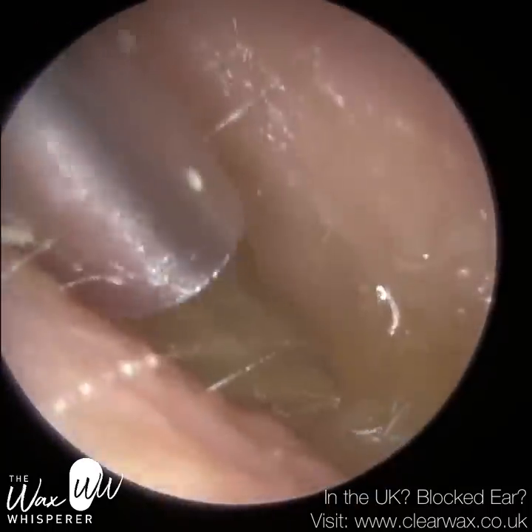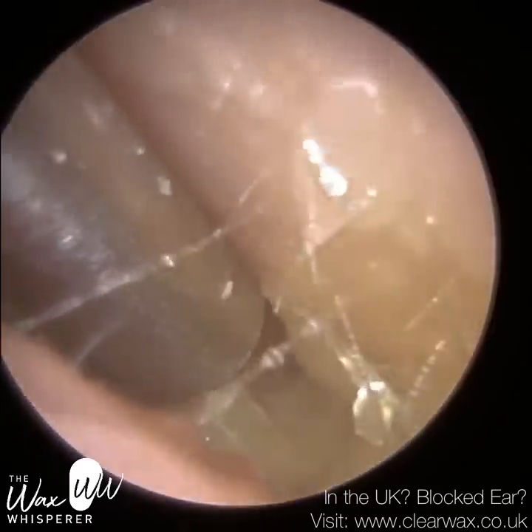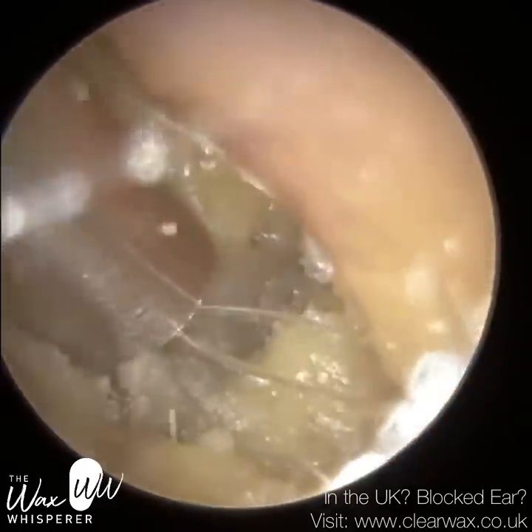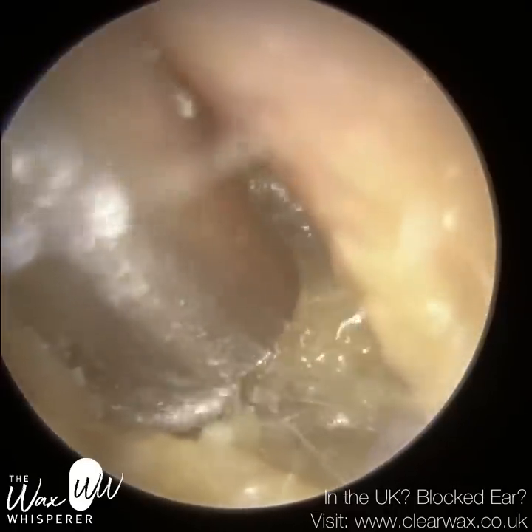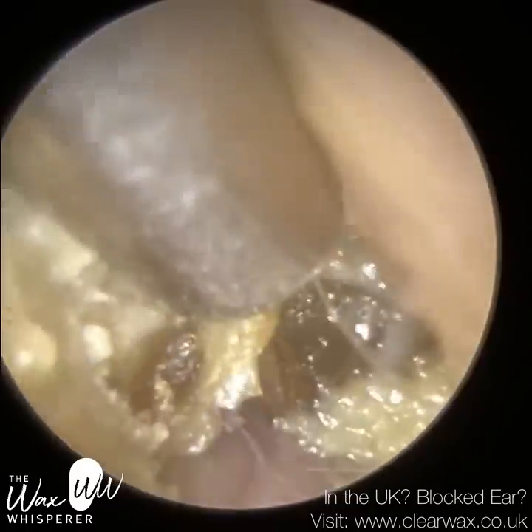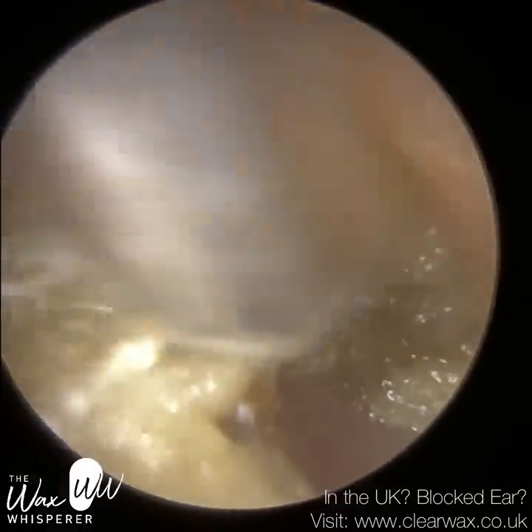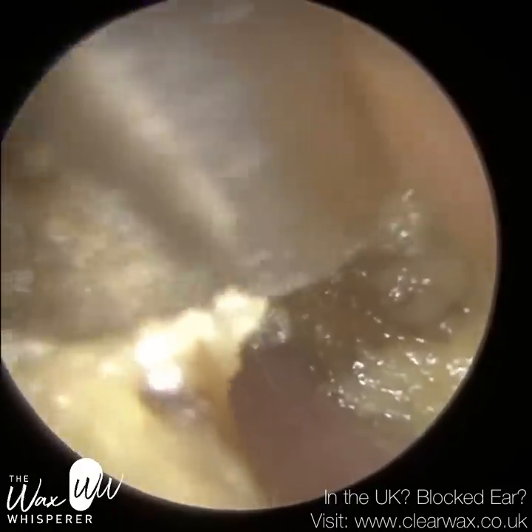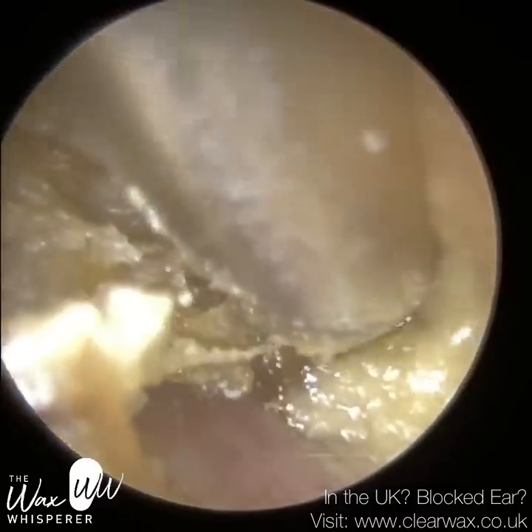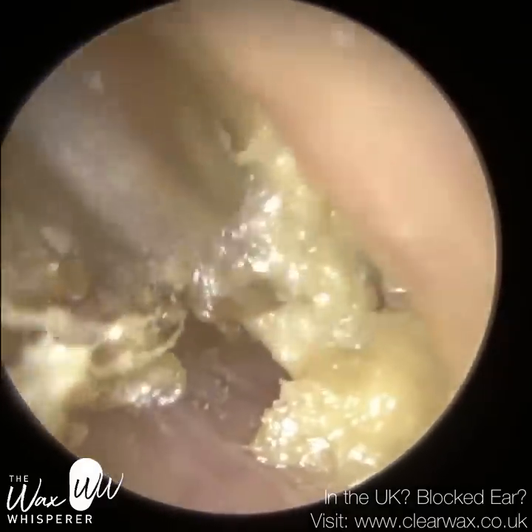This is of a patient who attended with a condition called medial canal fibrosis, which gives the appearance of a false fundus. And I'll come on to that in a moment. Now, we're just commencing with this right here, and the medial canal fibrosis is actually present in their left ear. So once I've removed this blockage from the right ear, we'll focus on what medial canal fibrosis is and why it gives a false appearance of a false fundus and what the definition of a false fundus is.